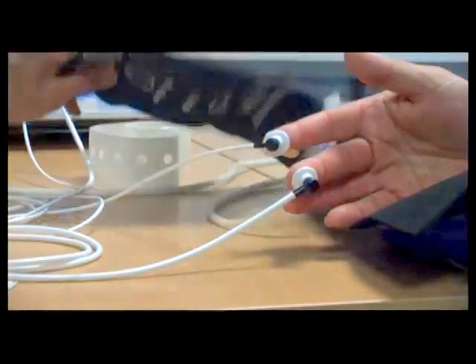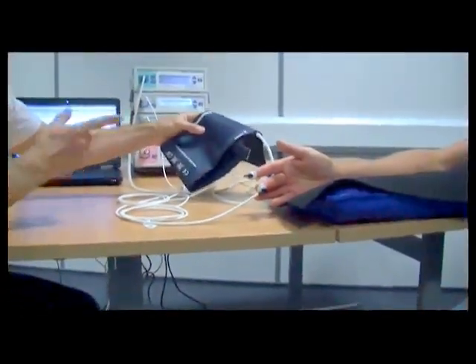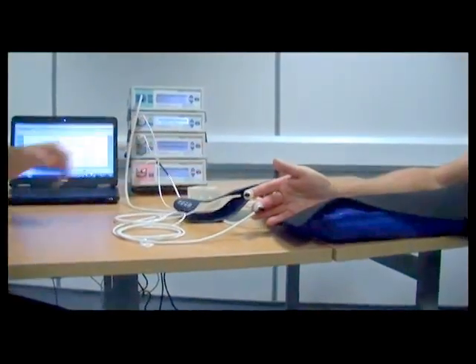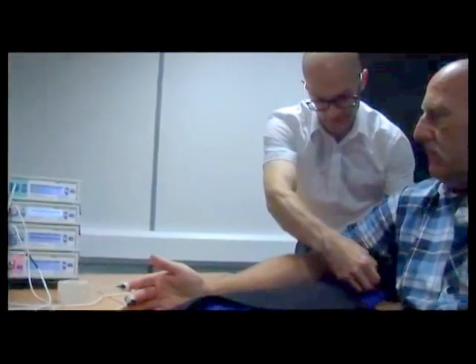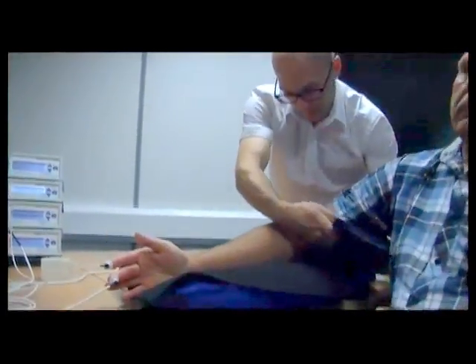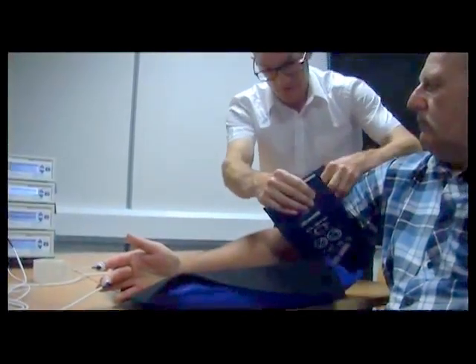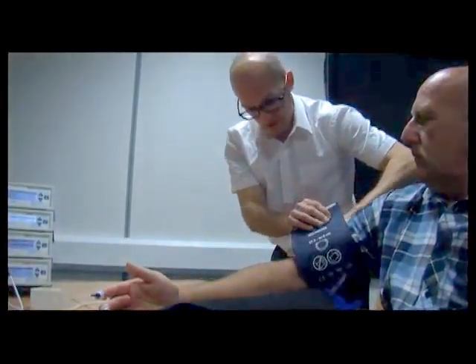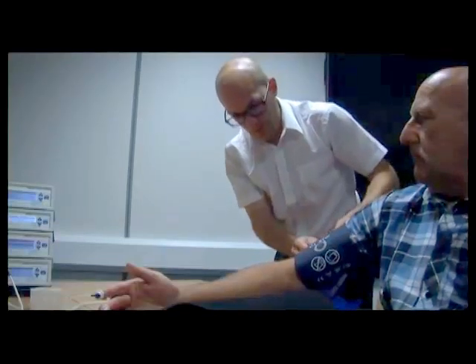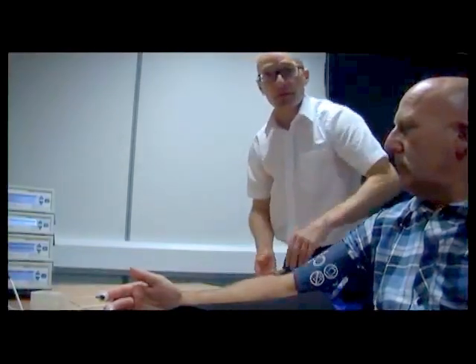Next, we're going to put the pressure cuff around the arm of the subject. So we take the pressure cuff, wrap it around the arm, making sure that it's firm around the arm but not too tight as to reduce the blood flow down the arm.